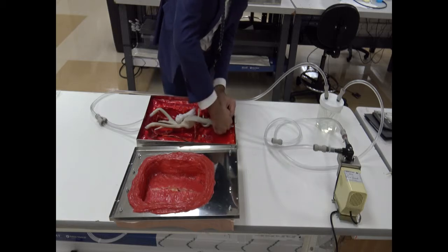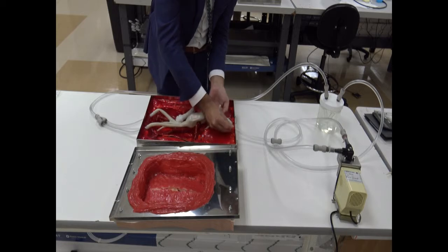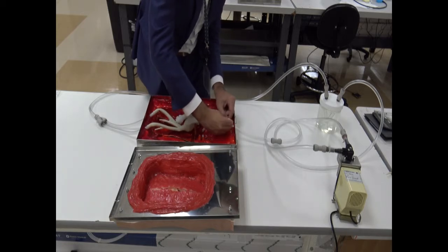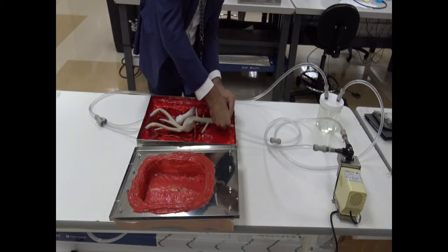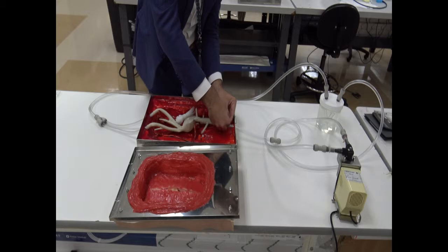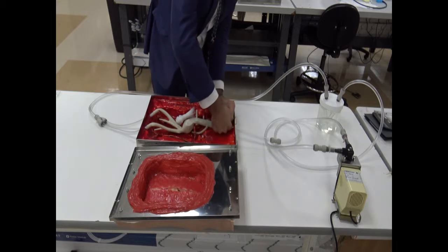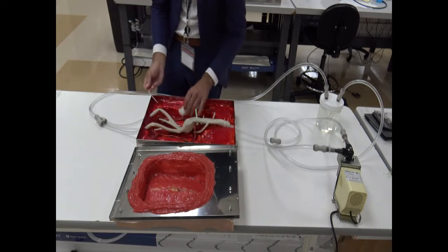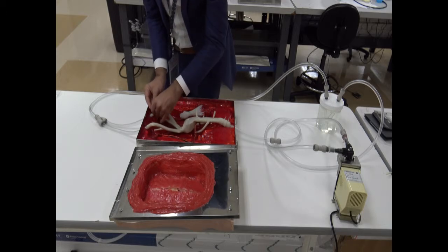I would recommend to have two, just to give extra fixation, like our infrarenal device with double level of fixation, right? Same thing. So we just tie two on the proximal, and then we're going to do one here on the distal.